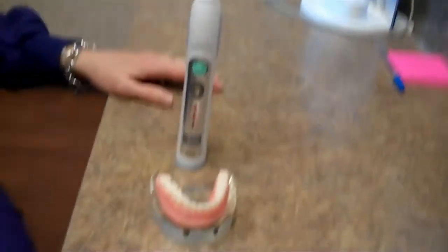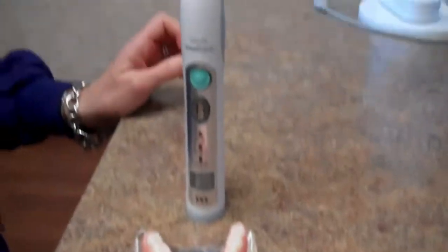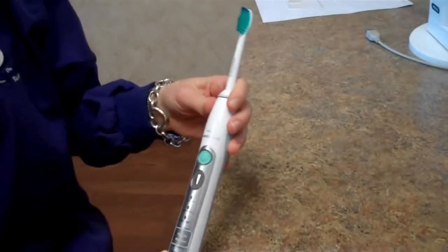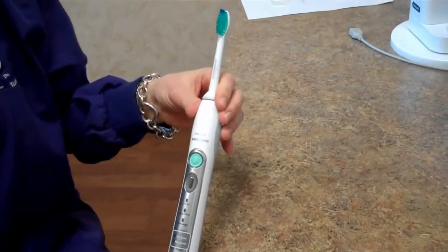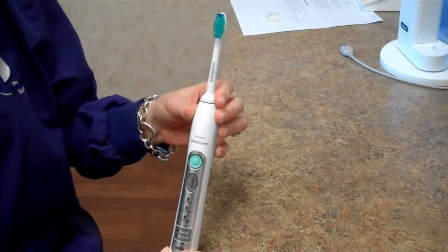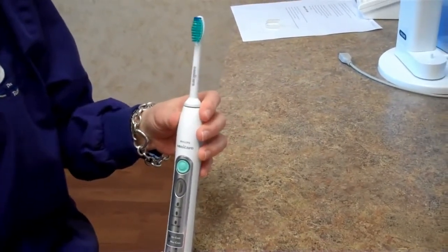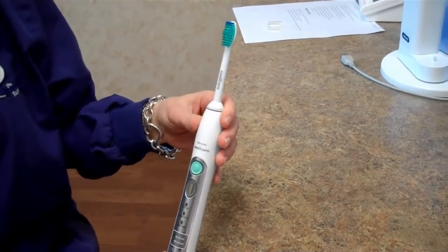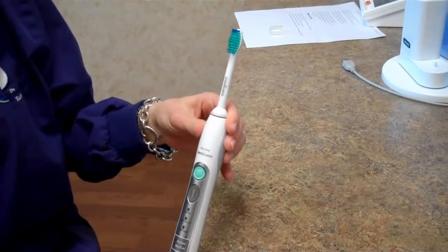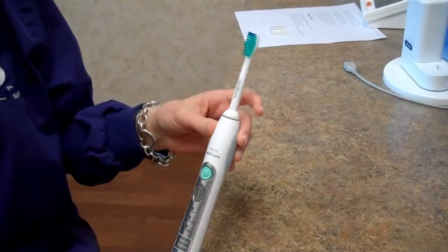Hi, this is Michelle from Periodontal Associates, and I'm going to take a couple seconds to demonstrate how to use a Sonicare toothbrush. Sonicare is what we recommend here at Periodontal Associates, and it is important to use a sonic electric toothbrush because it is able to remove 100% more plaque than a manual toothbrush. It is gentler on your gums, and the sonic motion is able to sweep fluid in and out between the spaces in your teeth and get down to the plaque below your gum line.